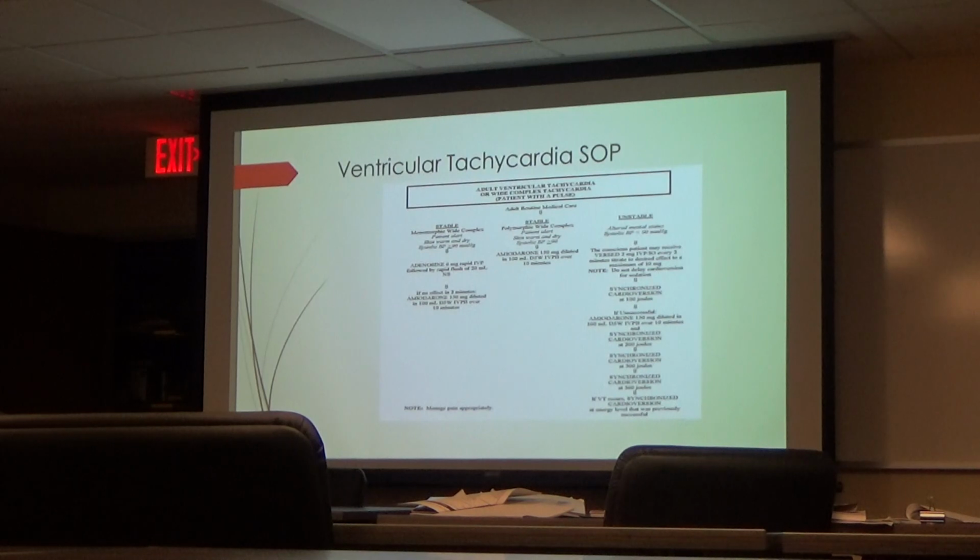What we're looking to do, though, is to use our amiodarone. We put 150 milligrams in 100 cc's of D5W, running in over 10 minutes. Now we've always taught you that anytime you piggyback any drug, we go ahead and use microtubing for it. With this, because we're only running it in over 10 minutes, you want to use macrotubing.